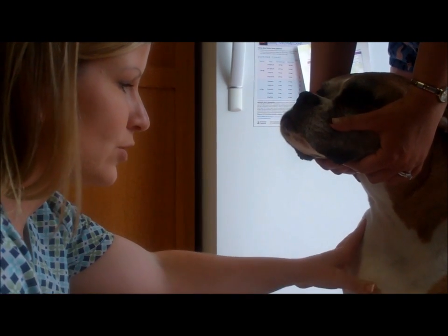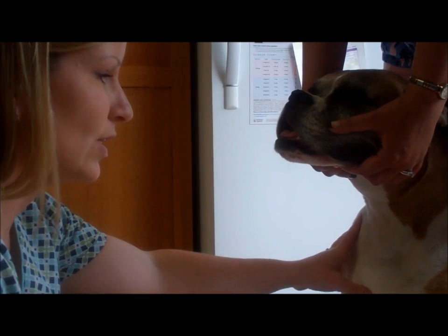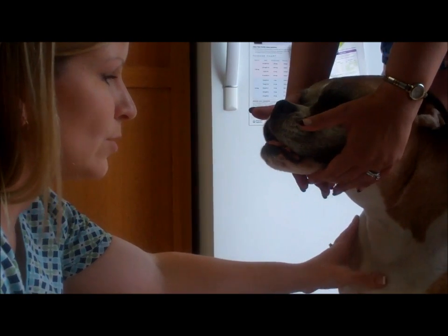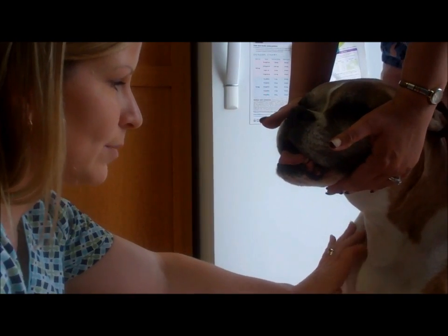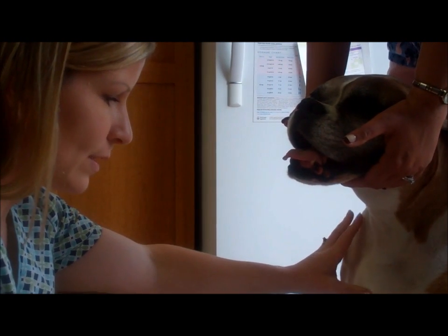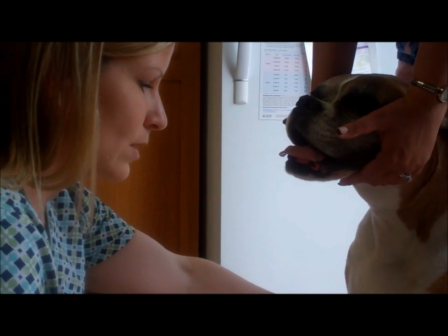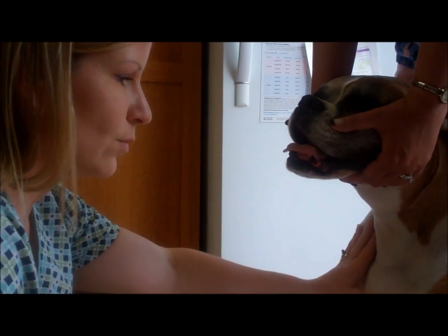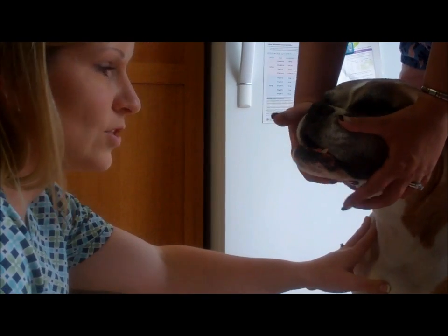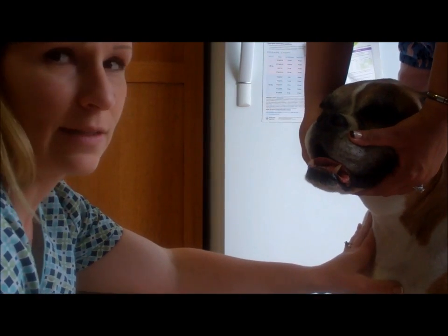Part of jugular blood drawing is mainly the position and the restraint technique by the technician who is holding. Most importantly, you want to make sure that the person holding is doing so correctly. If not, the person drawing the blood should be directing the restraining technician where to move the head or body so that the jugular is easily located.